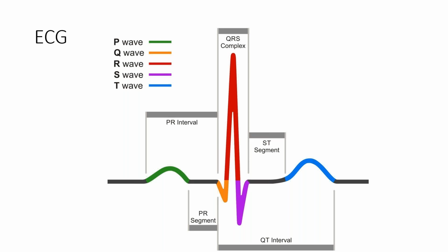So she said that some medications prolong the QT interval, so they might have to adjust the dose of medications if the QT is too long. That's a number that just pops up on the screen in some of our ICUs. One of the ICUs I work in is the cardiothoracic ICU at work. So I see it on the monitor, but don't really know a lot about it. It either works or doesn't work. It's one of those things where, why aren't we getting our QT measurement? Probably your leads is the most common thing.